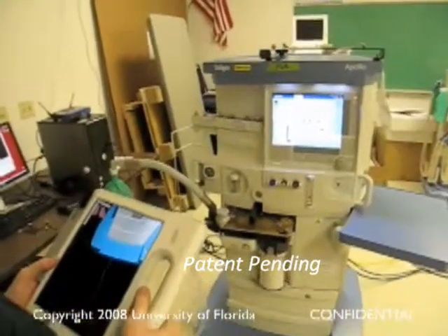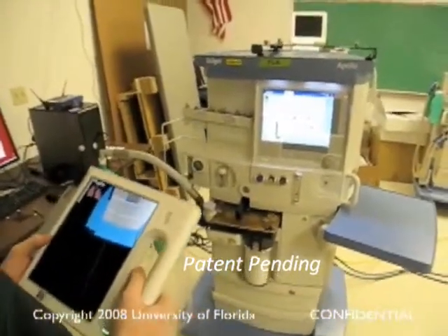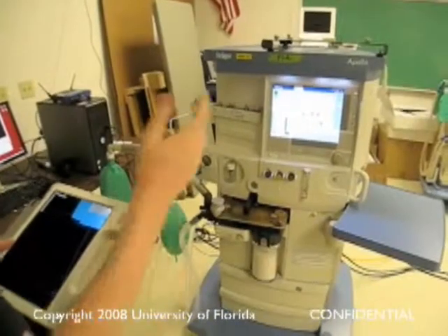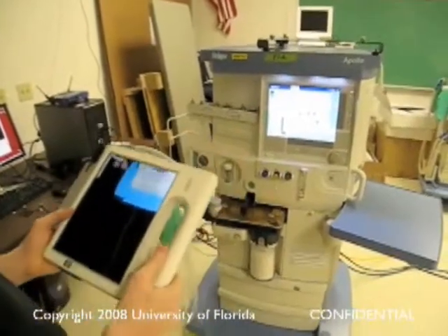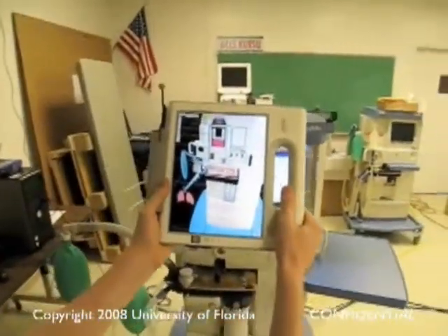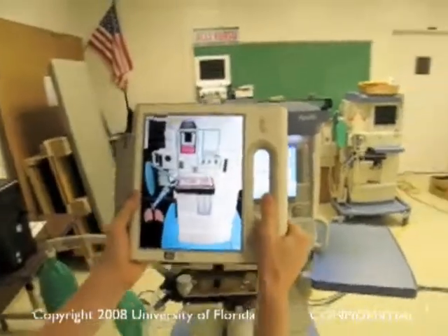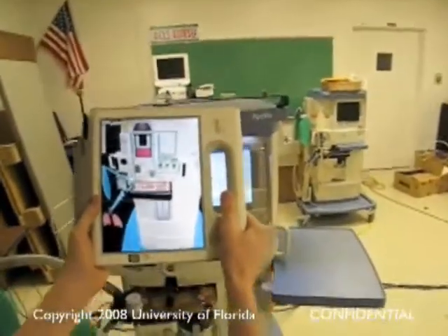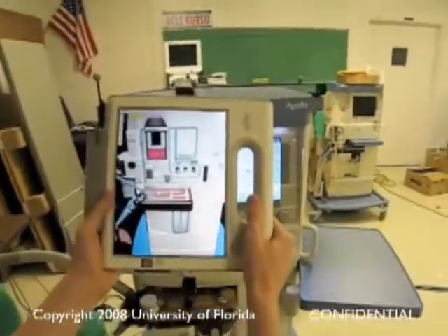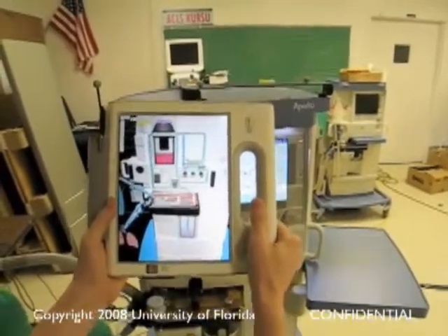This is a demonstration of the augmented Apollo anesthesia machine. You can see the machine here, and if you look through the lens, you can see our abstract simulation visualization of it.